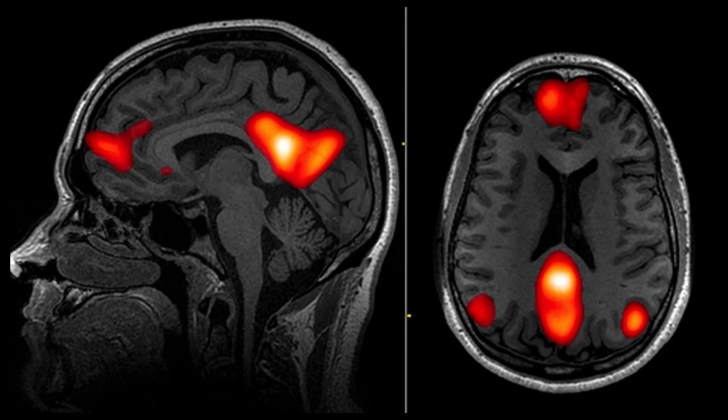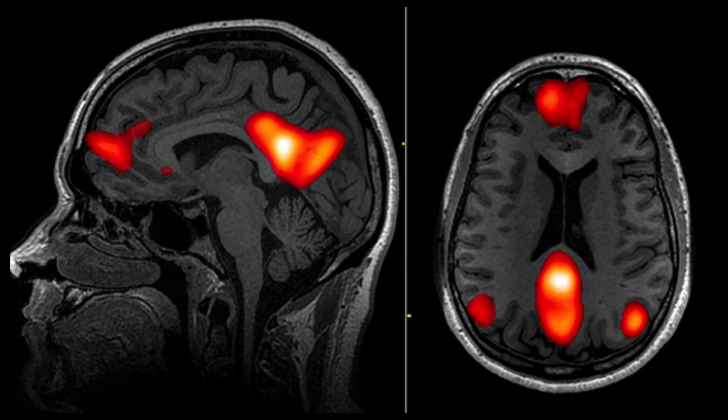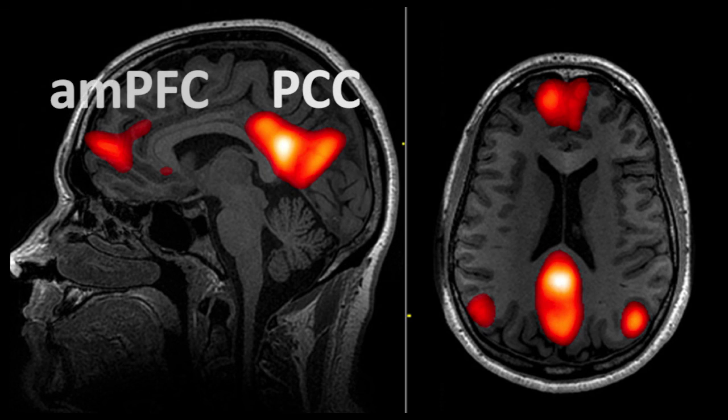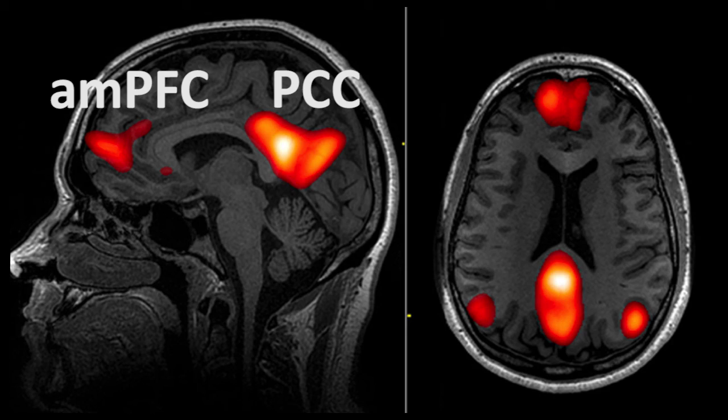Today we're going to focus on a resting state network called the default mode network, probably the most widely studied and most recognizable resting state network. The default mode network is a correlation between the posterior cingulate cortex and the anterior medial frontal cortex. We're going to use some online data to try and detect this resting state network.